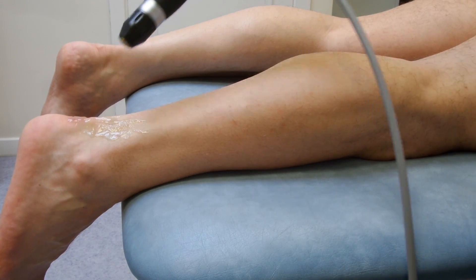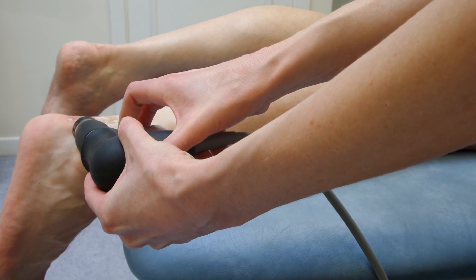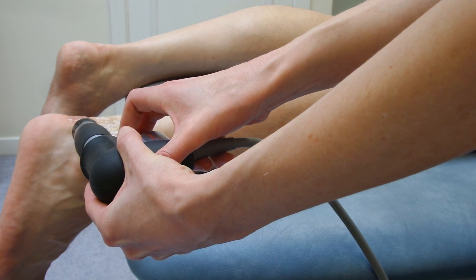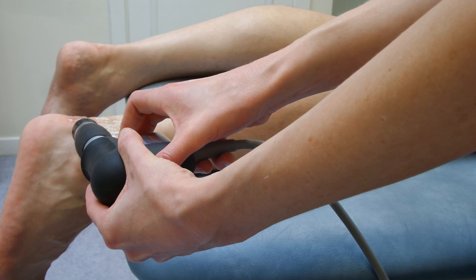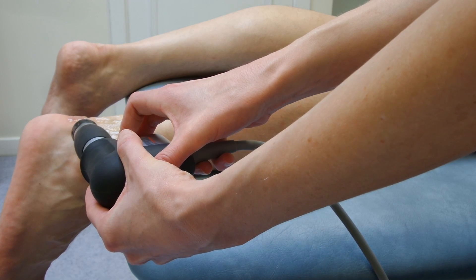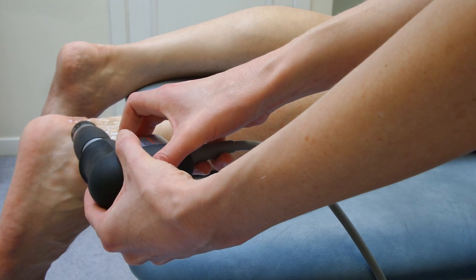The reason for that is that they still get changes in the spur for four weeks after you've finished the treatment. And so you don't really want them putting heavy impact loading through it during that time. Just coming up to the end of the treatment now.